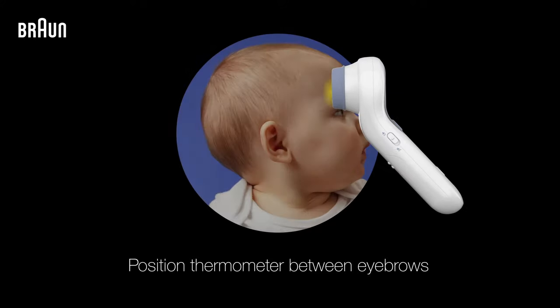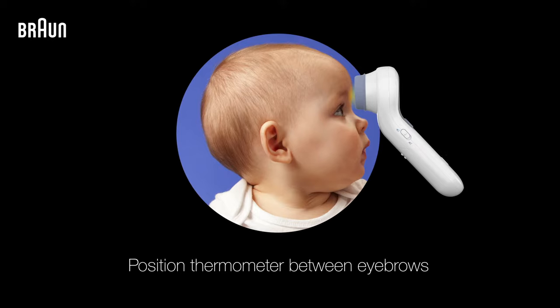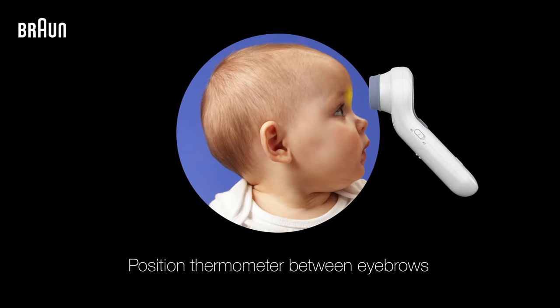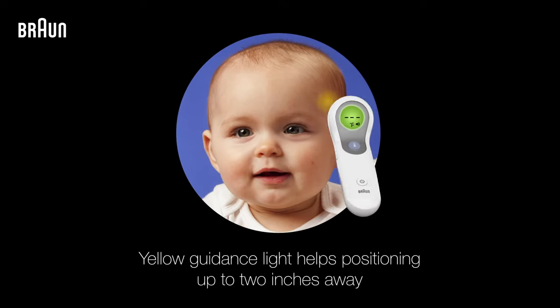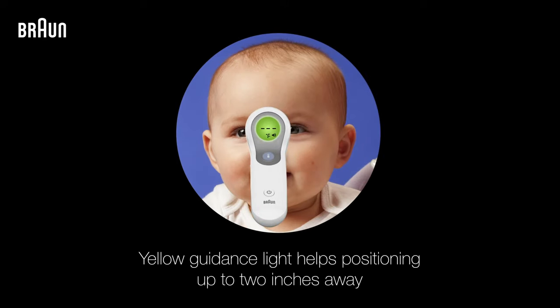Once the forehead is clear, position the thermometer either directly on the patient's forehead and between the eyebrows, or up to two inches away from their forehead. A built-in yellow guidance light will help guide your thermometer and ensure it's in the correct position.